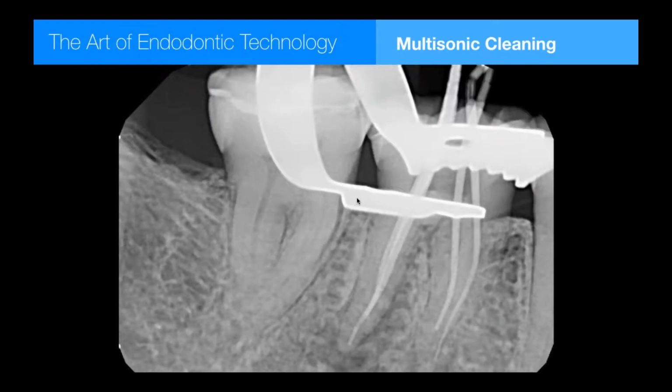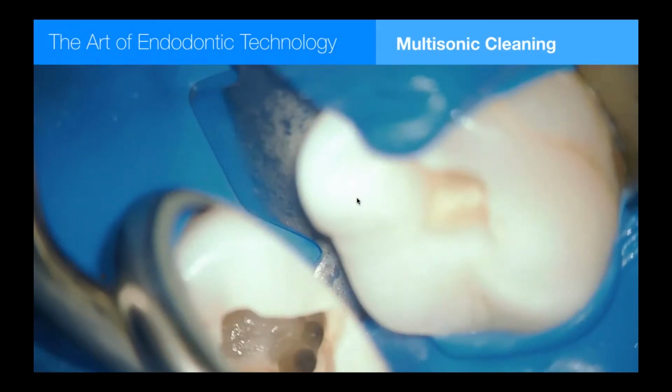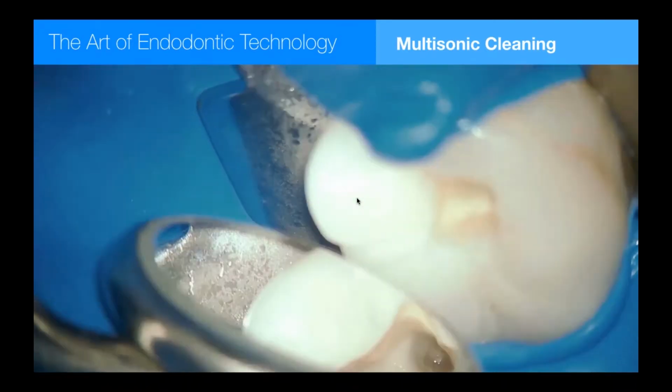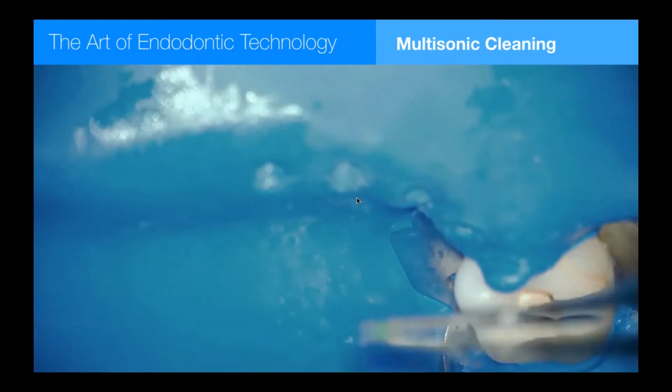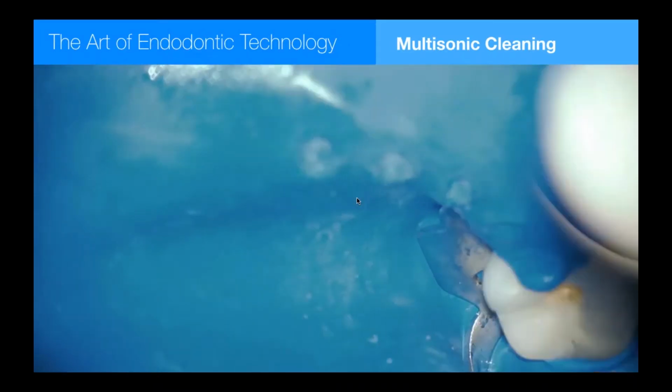You can see I'm able to fit 2 cones in the distal canal, 0.5 millimeter from length. In the mesial canals, I'm not even within 3 to 4 millimeters. So in this case, the apical anatomy is so tortuous in the mesial canals, I could get bent negotiating files there, but I never could fit a cone there. So I'm going to fill those with carriers.